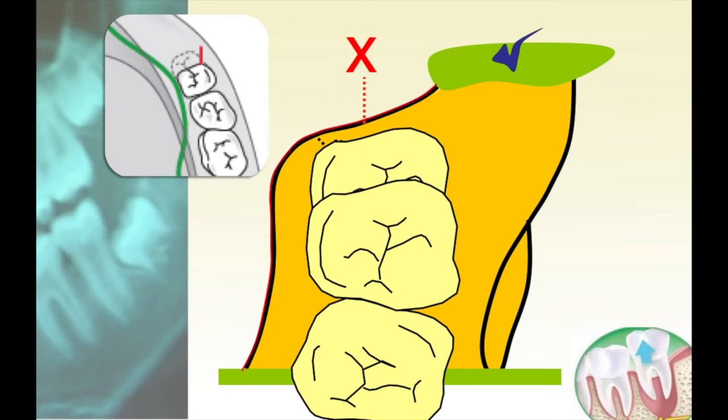So in the mandibular posterior region, we stay away from the lingual concavity as well as the medial surface of the jaw. Next, we place our incision on sound bone. And since the mandible has a lateral trajectory, our posterior incision also moves laterally.